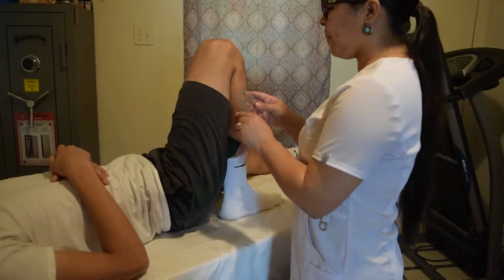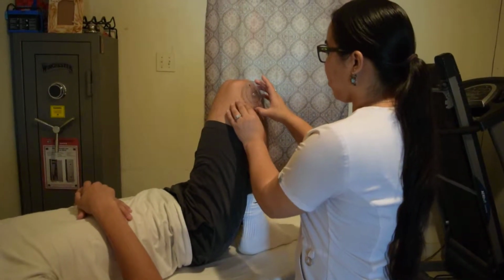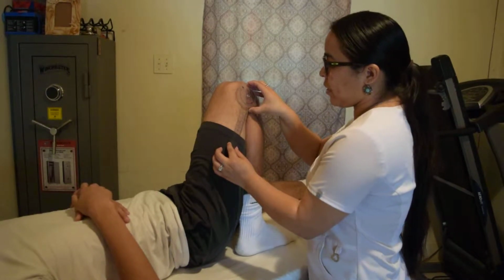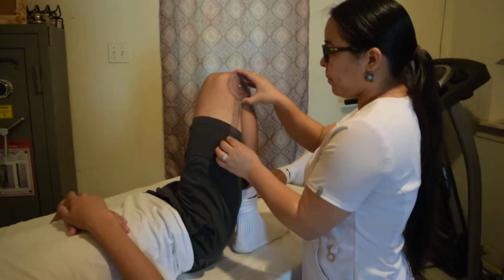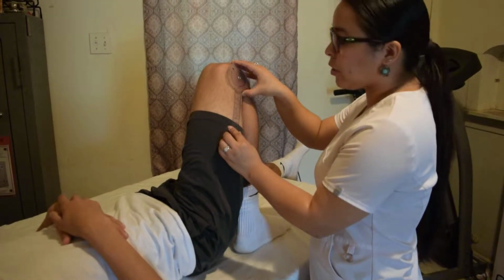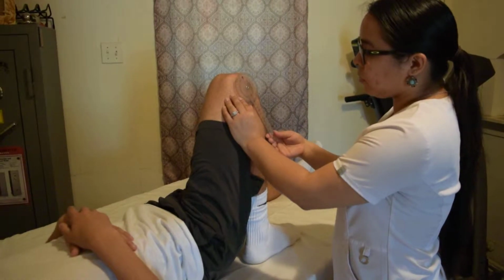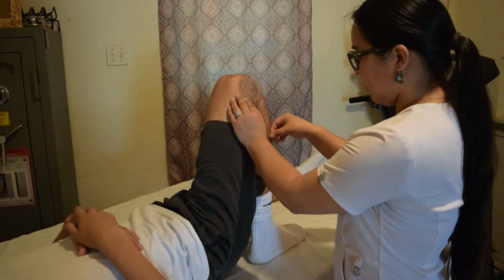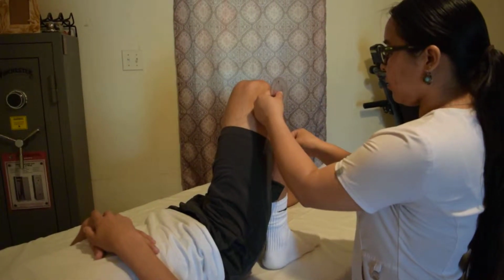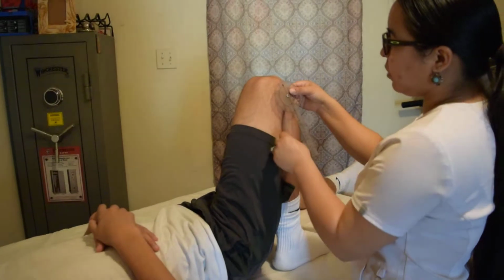Now using the goniometer, this here is known as the axis or the fulcrum. So this has to be placed on the lateral epicondyle of the femur. This right here is a stationary arm, which is the proximal arm. It has to be lateral to the midline of the femur, which is also known as the greater trochanter. This over here is the moving arm, also known as the distal arm. This has to be lateral to the midline of the fibula, also known as the lateral malleolus. So here, his knee flexion would be 0 to 150 degrees.